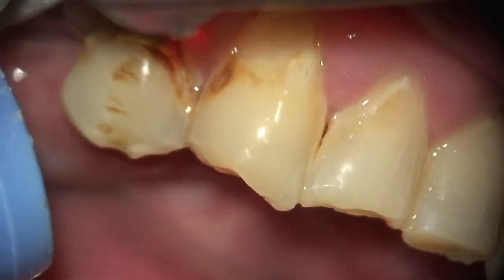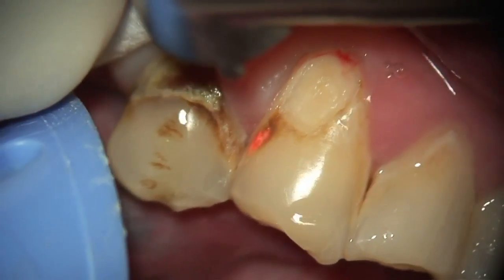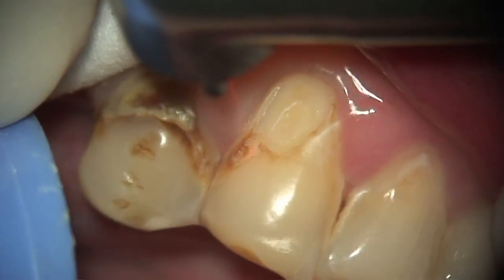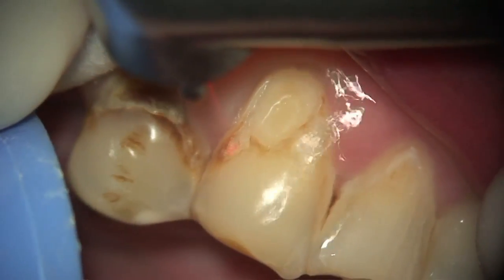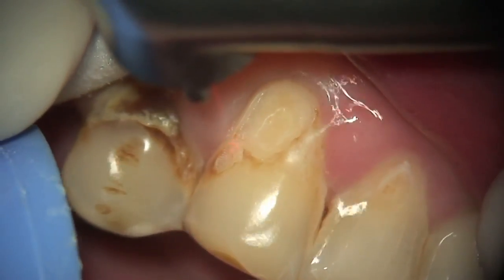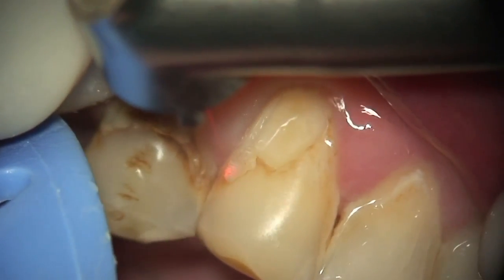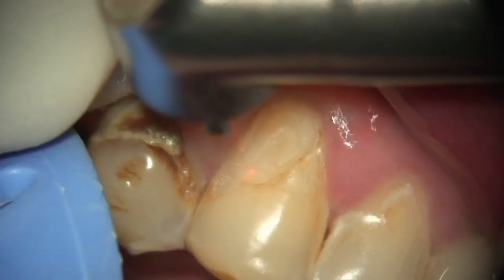Because we don't use a topical or local anesthetic, one of the advantages is that I can do multiple restorations — not only in the same quadrant, but in other quadrants as well — which allows me maximum productivity for the patient. I don't have to have them come back for multiple visits. It opens up chair time for other patients and other procedures, it's very productive and a great return on investment.